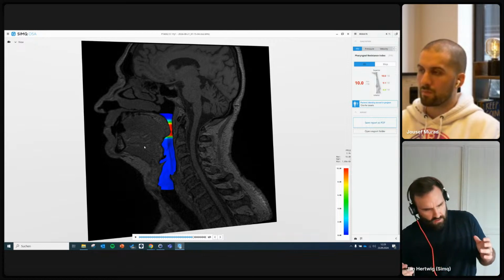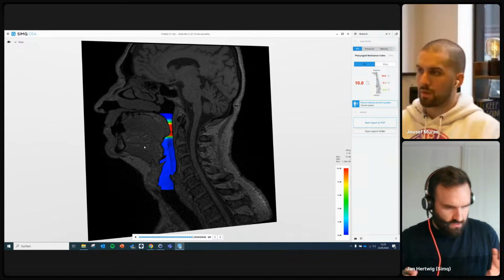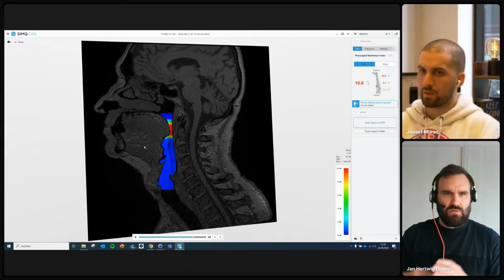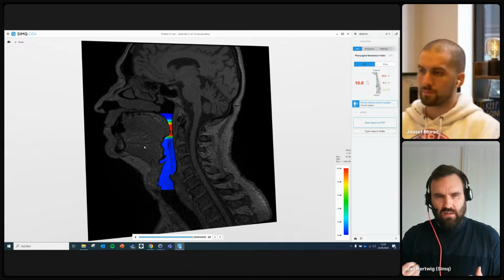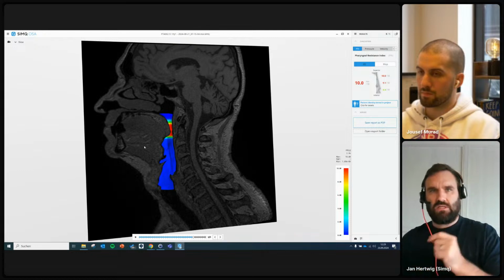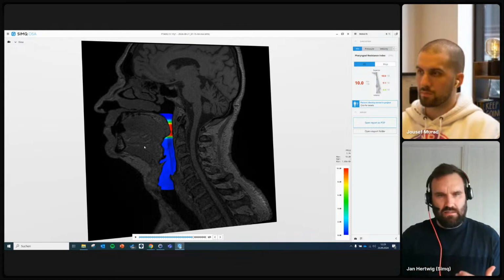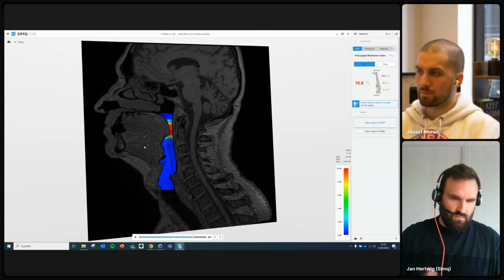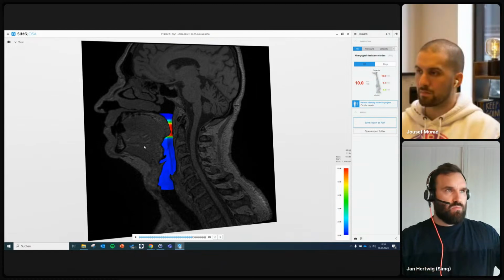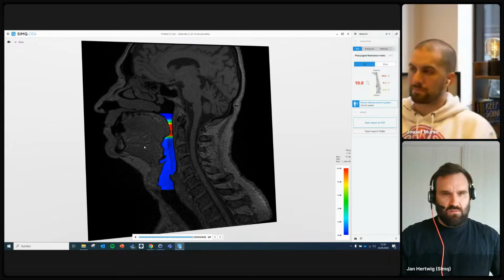So that's how you can use it, and very easily. Another important thing is that we are using really patient-specific data. We're using machine learning to set up the models and also to interpret the models, but every patient gets their own digital twin, and we derive decisions based on those analyses, and not on an ML algorithm. I'm not saying that machine learning and AI are not good, but basically what an AI is doing is having a trained database, like 500 patients, 1,000 patients or more.